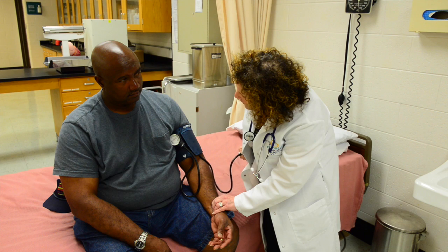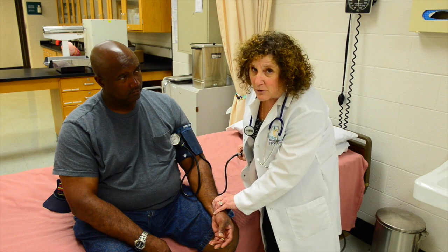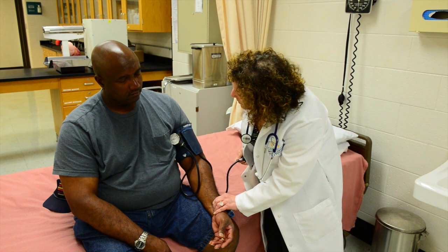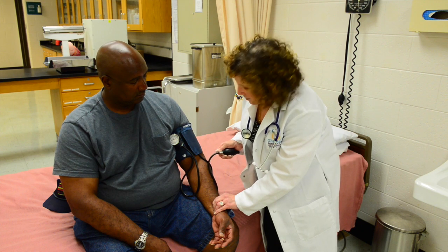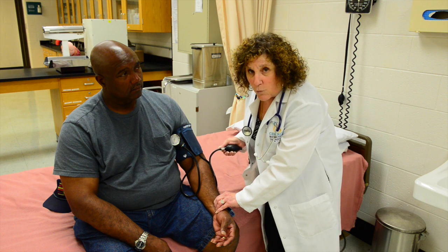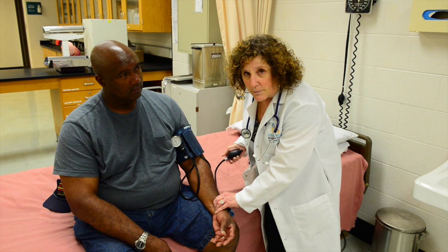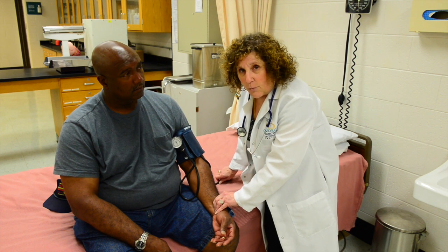I no longer feel his pulse, so I'm going to inflate it 30 mm of mercury higher. Now I'm going to slowly release the bulb, and when I start to feel his pulse again, that is what is called palpatory systolic pressure. You need that in order to take a proper blood pressure.